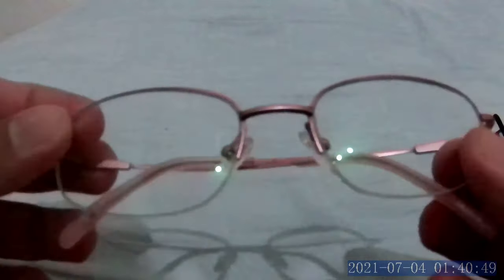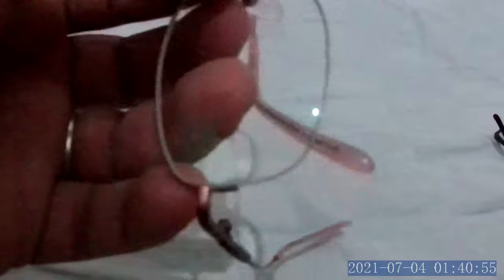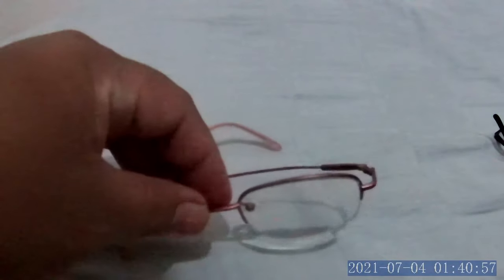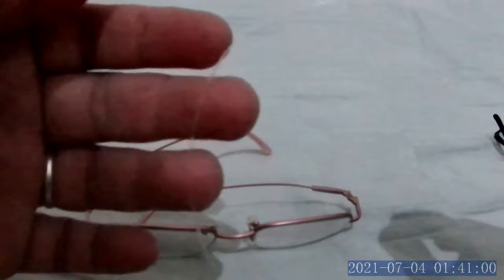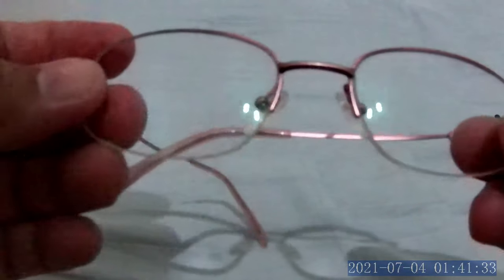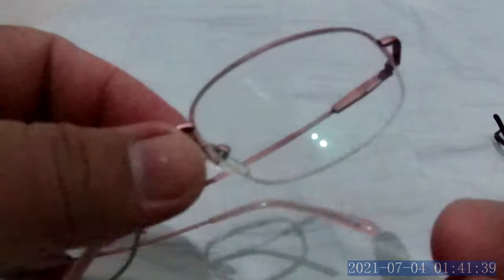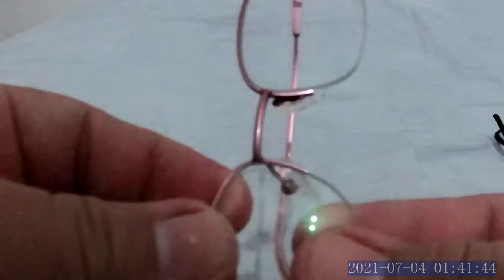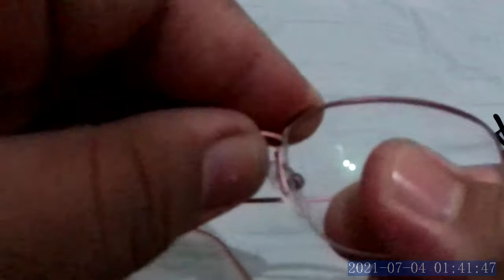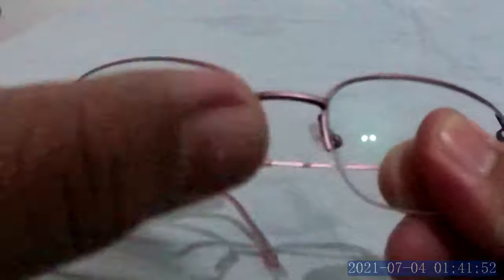The second method: especially if you are a woman, it can be hard to apply enough force to remove the lens. In that case, you need to get a string — you can see here I have a string like a fishing line, nylon. This is the way to remove the lens without force.